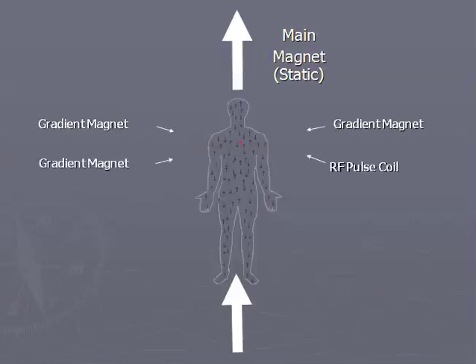The trick of the MRI is to use much smaller magnets from the side that can alter the direction of these non-canceled hydrogen protons in a specific direction. A pulse of radio frequency energy at a frequency specific to the hydrogen proton is then used to impart energy to the proton that helps image or see it on the MRI scan. MRI is a complex topic, and the discussion will be limited here to contributions to electrode lesions. Let's look closer at each MRI component.